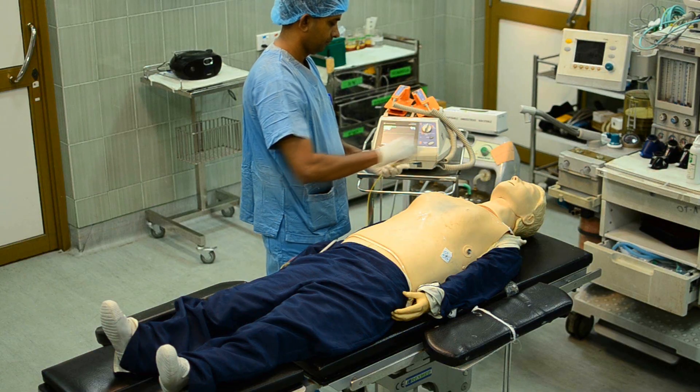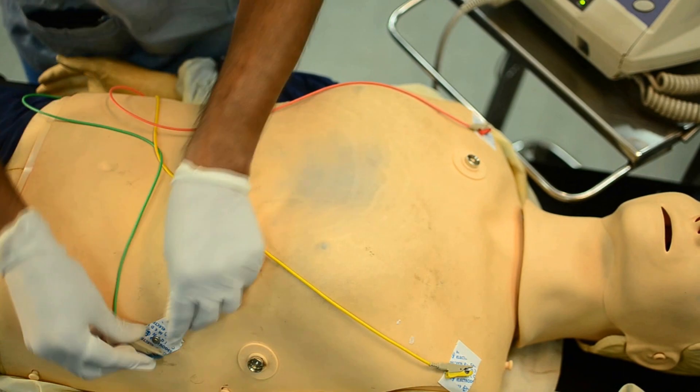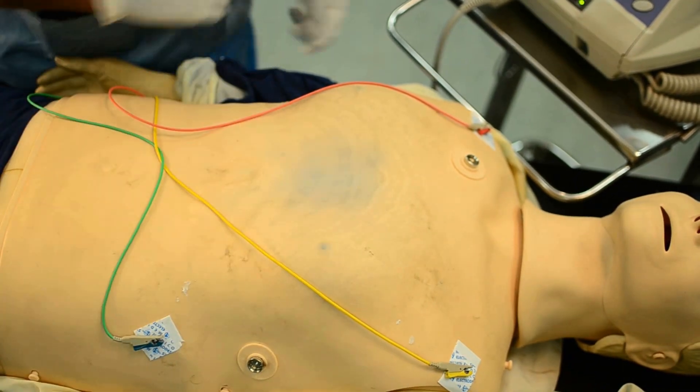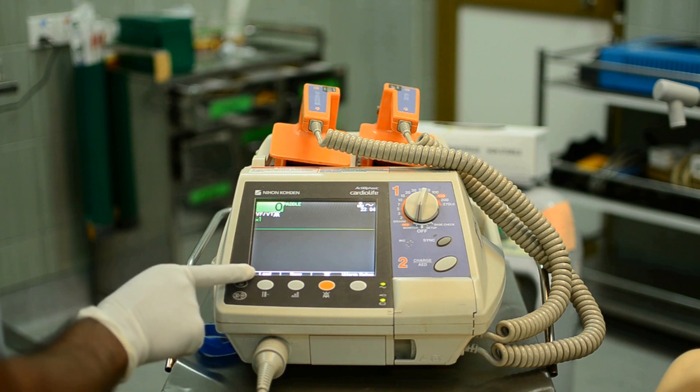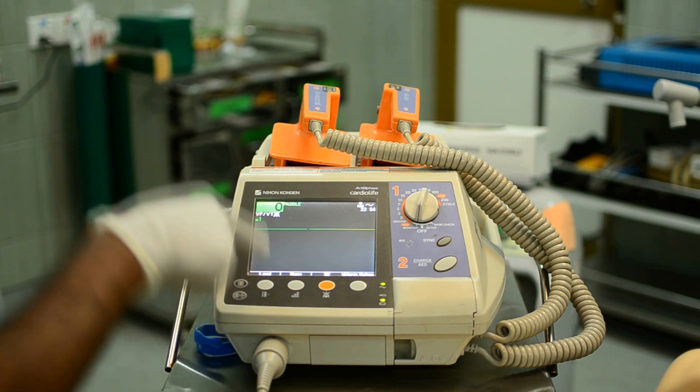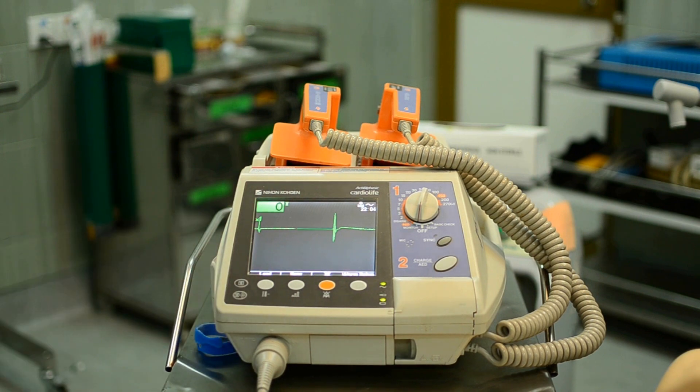Connect the red wire to the right shoulder, yellow to the left shoulder, and green at the apex of the heart. Now you have to monitor through wires. For this, press the lead button. If you press two times, lead 2 will appear on the screen and it starts monitoring lead 2.